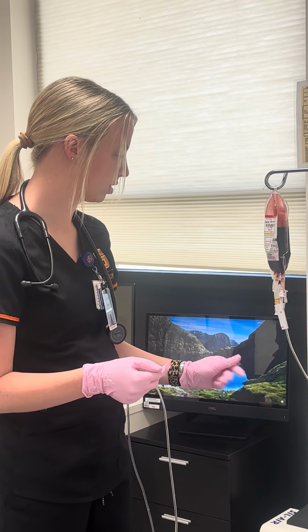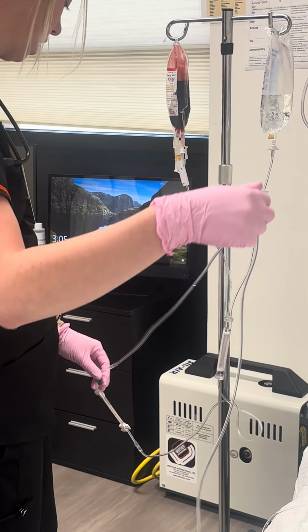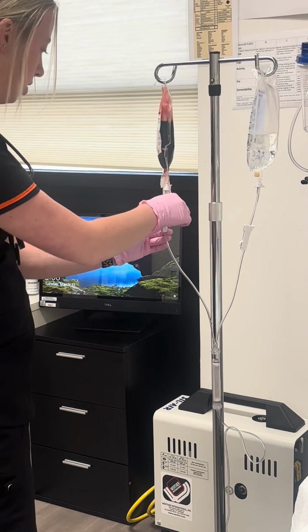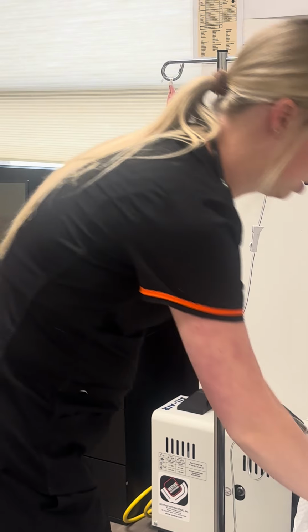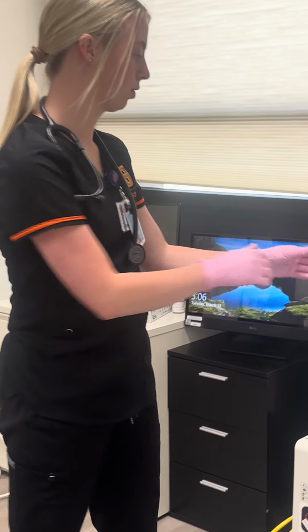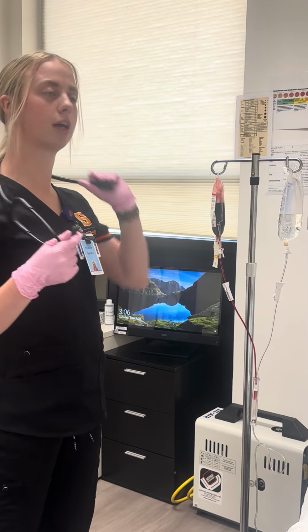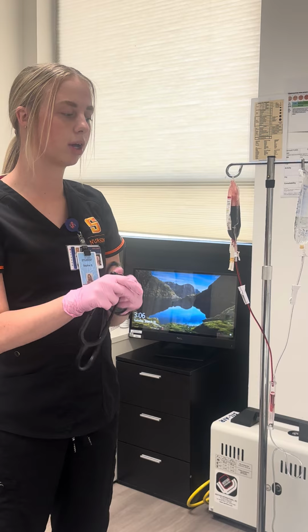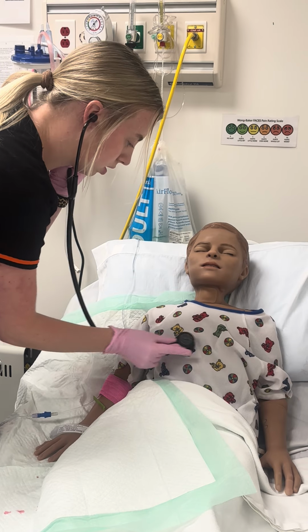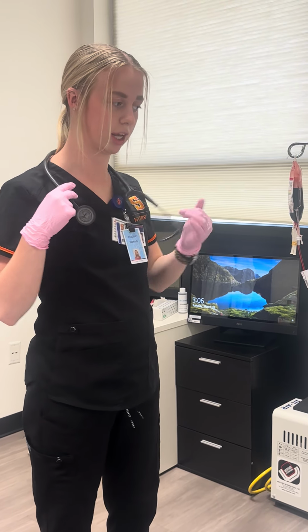So let's see if this decides it wants to run. At this point, I can unclamp everything other than the saline because we want the blood to run down. Okay, everything should be running. That looks good. So like I said, we're going to run it on a lower amount for a minute, and then at 15 minutes, the biggest thing I want to check for with vitals is those fluid sounds again. So I would listen to my 6 spots, and for the sake of time, I would listen to the back as well, checking that distension.